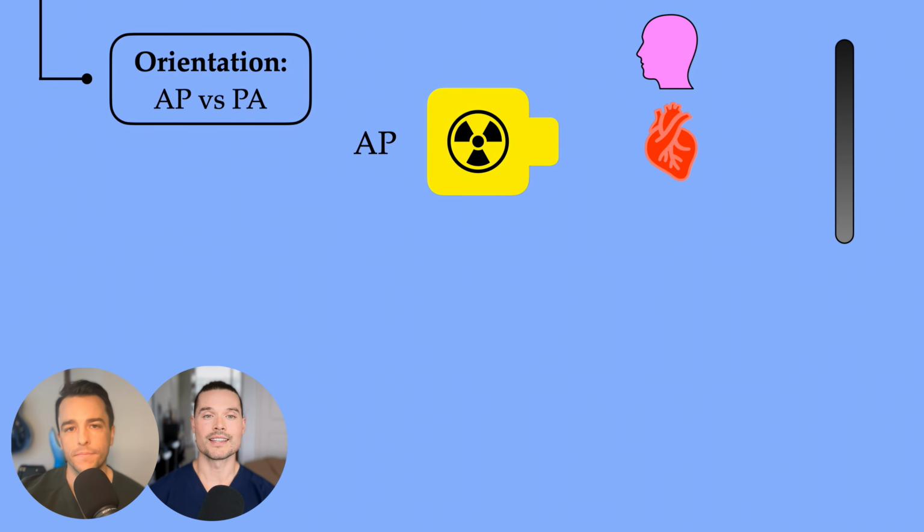And our last plane here is sagittal. So we have the anterior portion of the patient on the left of your screen and the posterior portion of the patient on the right of your screen, with the vertebral column seen there. We have cephalad towards the head and caudad again towards the feet. When you guys are going through these, make sure you're using all of your planes, because sometimes you can see images better in one plane than the other, and we will definitely get into that in more detail in future videos.